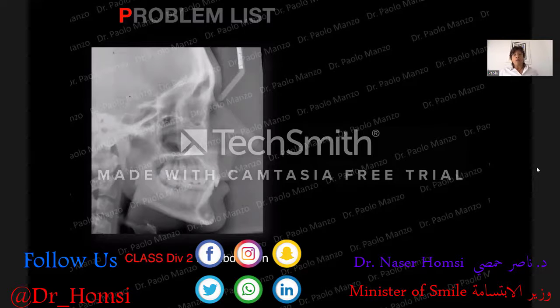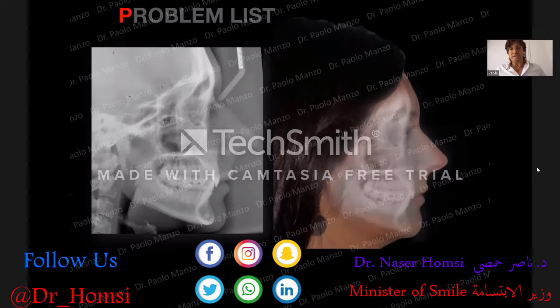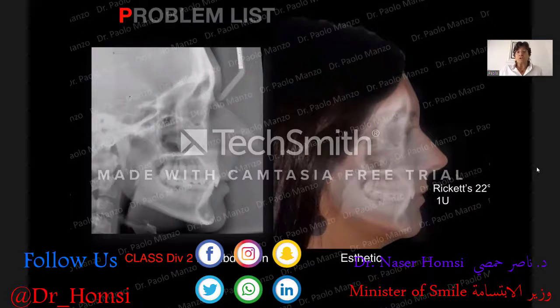So with the TRUA, we corrected the gummy smile, and then with class 2 elastics, we corrected class 2 division 2 subdivision on the right. So the class 2 on the right also affects the aesthetics of the patient. We know this has been corrected by means of high torque, so class 2 division 2, with the lingual inclination of the upper incisor, has been corrected by means of high torque prescription, because at that time I still was using Ricketts prescription. I was trained during my post-graduation with Ricketts technique.